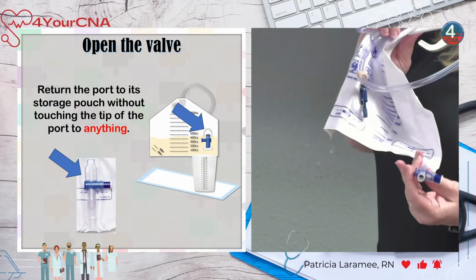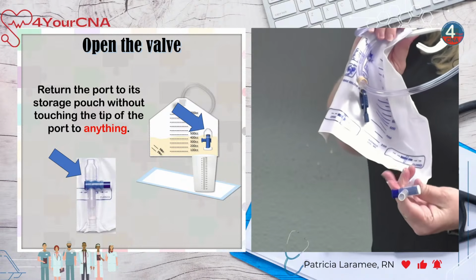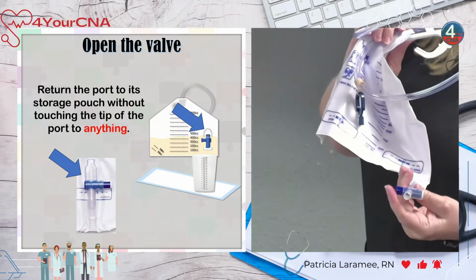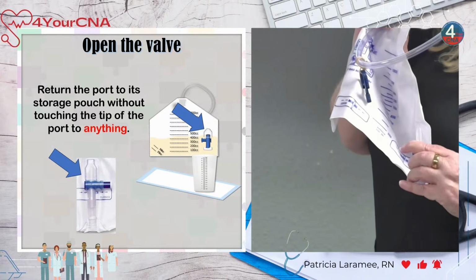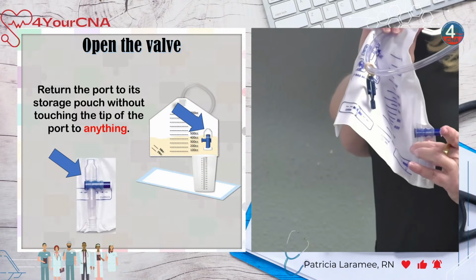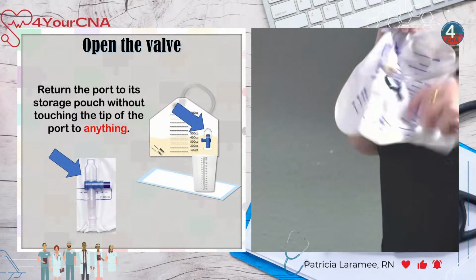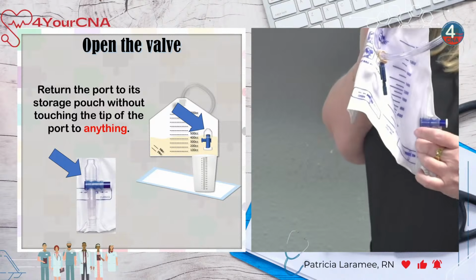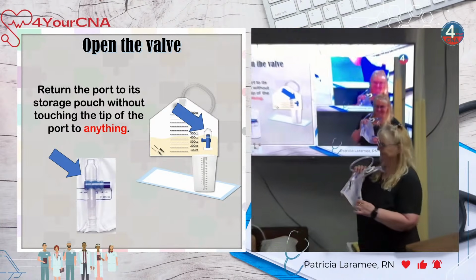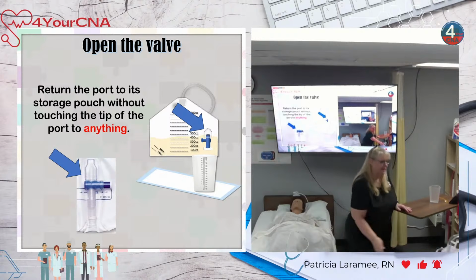So in order to open it, my fingers stay back here and I open. To close, my fingers stay back here and I close. Now to put it back in its house, you simply slide it up into its house without doing this. Good? Okay. You guys can play with the valve.